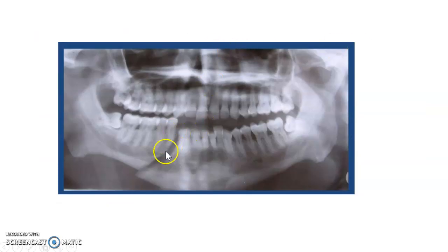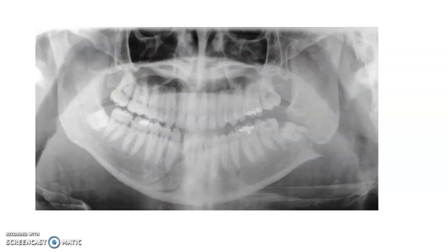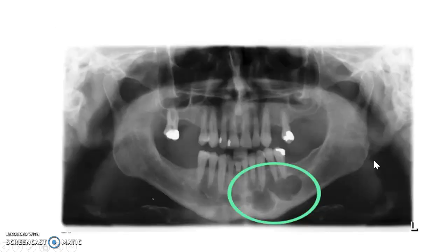Here's just an obvious fracture here going through the mandible. I feel like I always did these on Friday and Saturday nights when I worked third shift and the bars were kind of crazy, right? People were getting punched in the face. Here's a fracture here. See, the tooth is even dropped down in. I believe this is an abscess here. These little pockets.